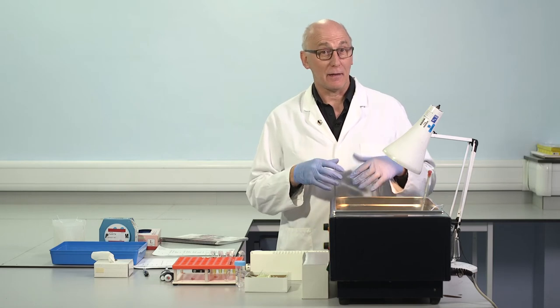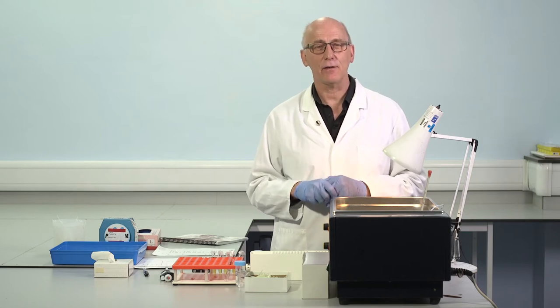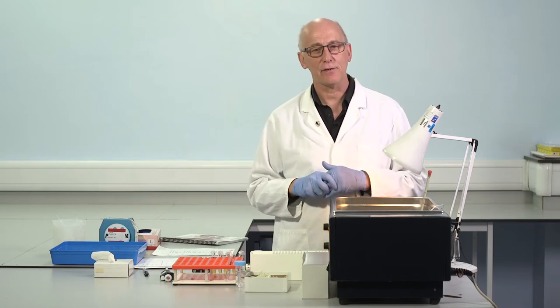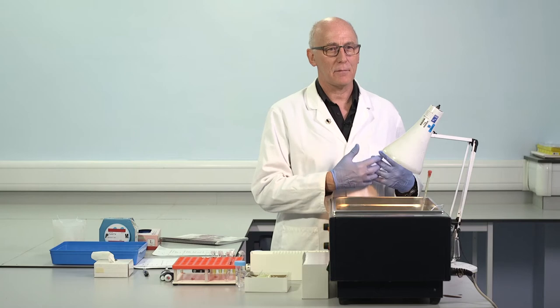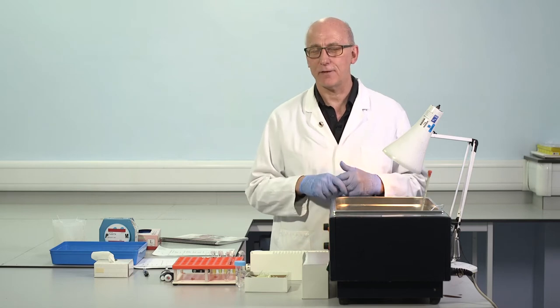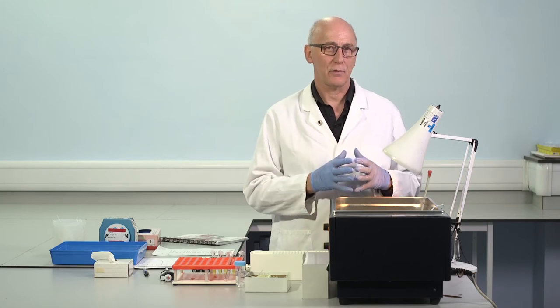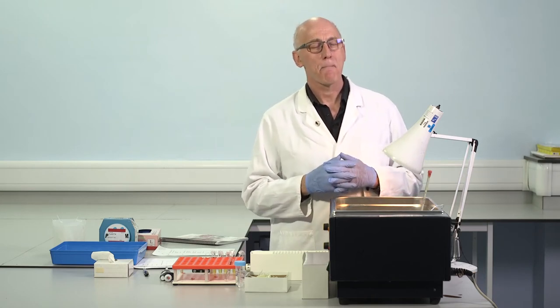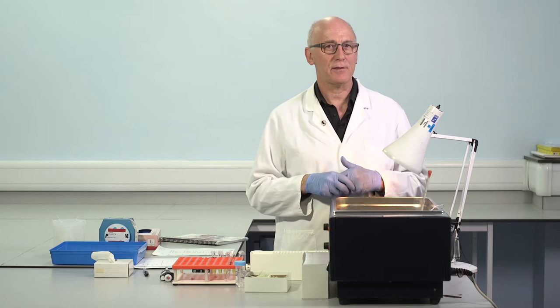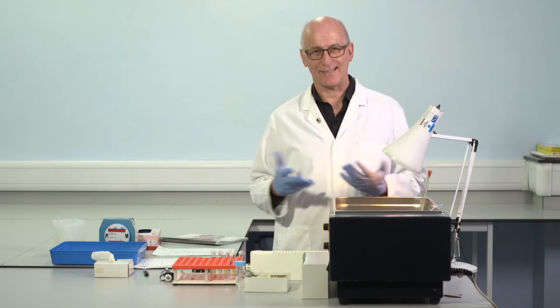If we've made a control locally, as we did in this case, then of course we have to ourselves assign a target range. And there's a section in the WFH laboratory manual that describes in some detail how we would recommend doing this. It's done by testing aliquots of the control lot number, on a series of different days, a series of different vials. And we accumulate 20 results over a period of at least 10 different days. And this allows us to take account of vial-to-vial variability, day-to-day variability, and we use that to construct a target range. And the target range we use is derived statistically.